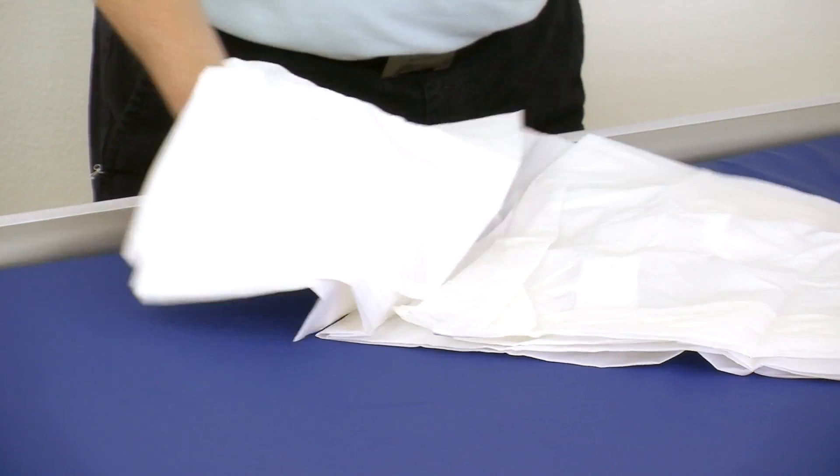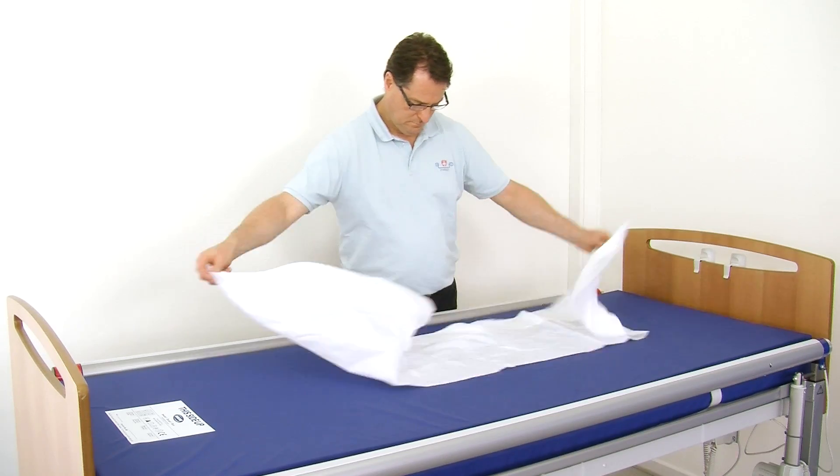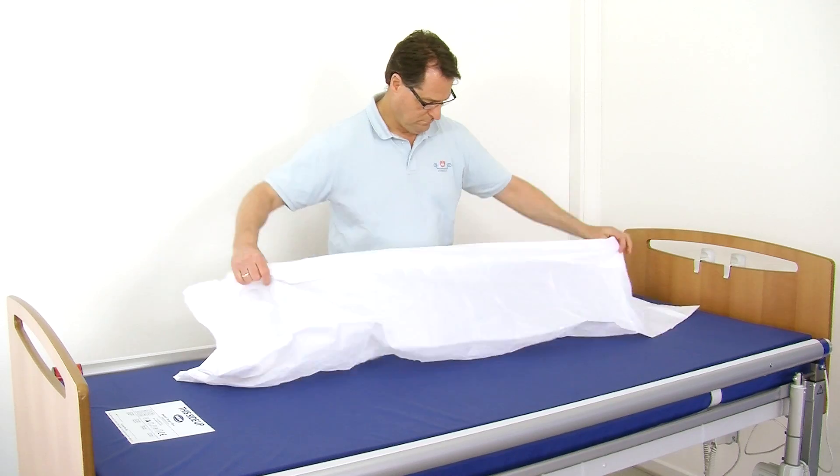A slide sheet should be mounted on the bed mattress. Unfold the slide sheet and place it on the bed with the seams down.